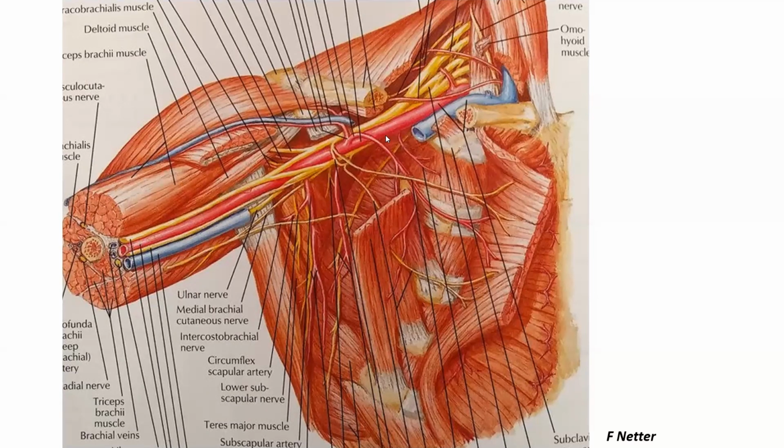But the more distal you go into that axillary artery, the more superficial it becomes, as superficial as the axillary vein. You can basically split or set apart the axillary artery from the axillary vein as you go more distally in the mid to distal segment of the axillary artery. And if you abduct, open up the arm.